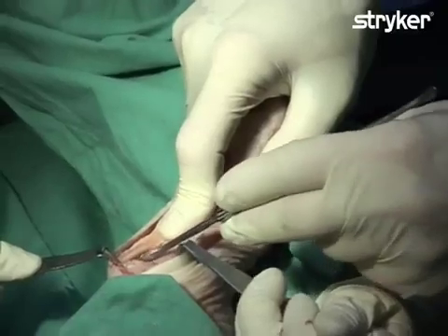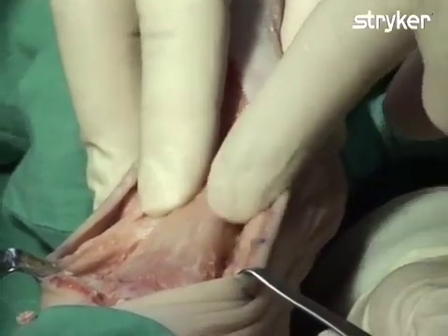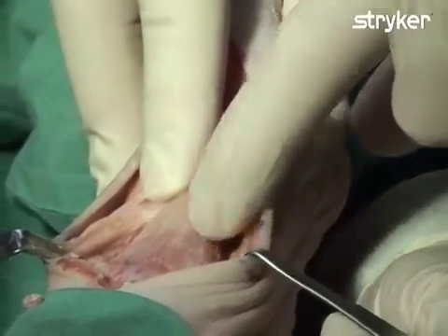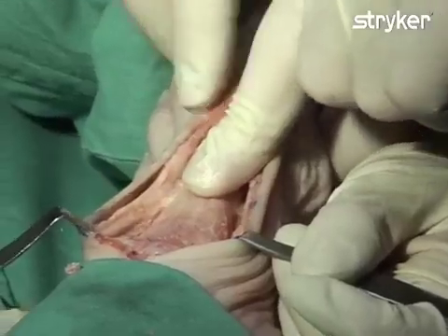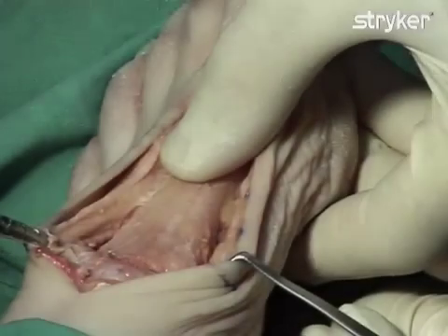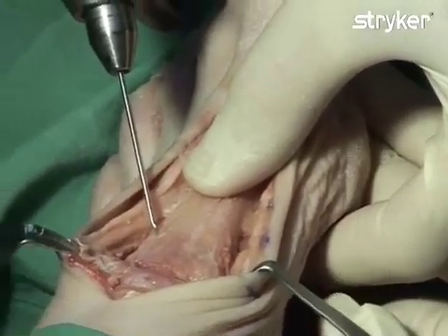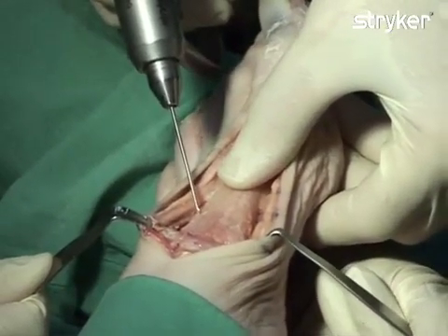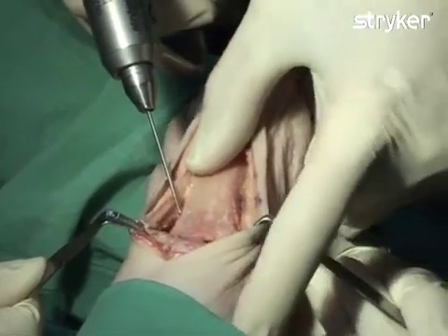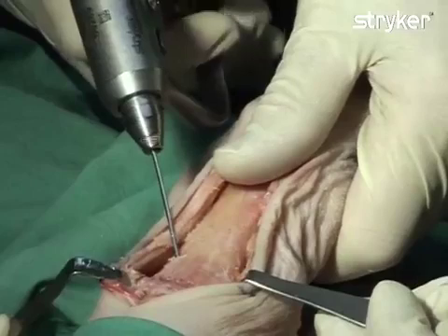A step-off of approximately 2 mm is therefore created. Hardware fixation will be performed by first inserting an ASSIS III 4.0 mm cannulated screw for compression, followed by a Variax Foot oblique T-plate. Temporary K-wire fixation is now performed. The entrance point should be placed approximately 1.5 cm distal from the osteotomy site in the dorsolateral part of the metatarsal, aiming at the tuberosity of the navicular.